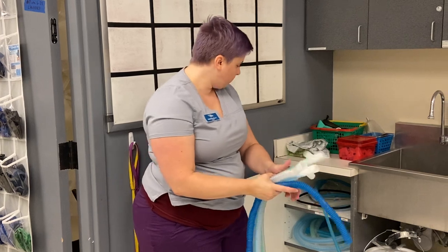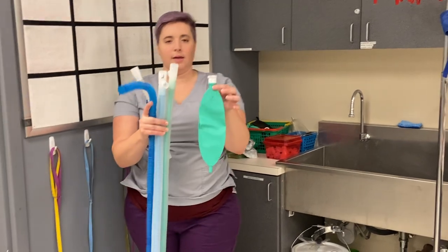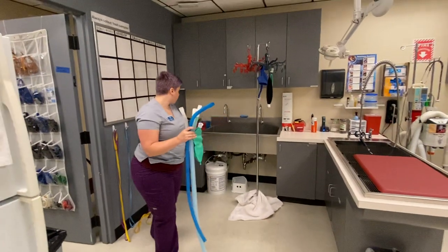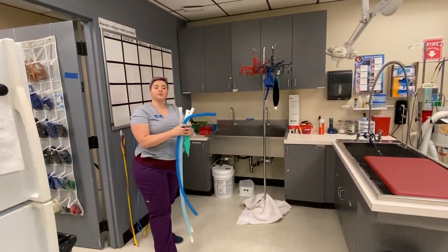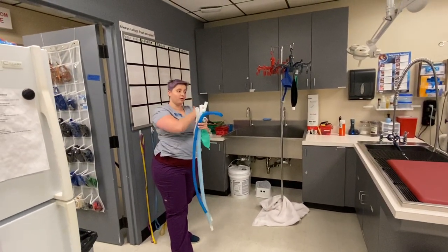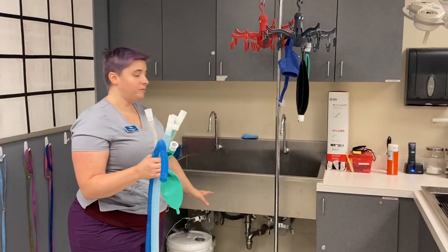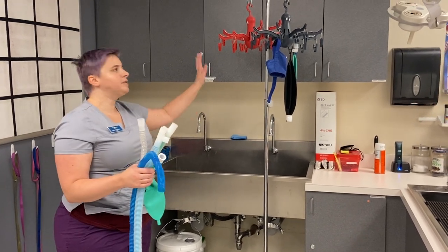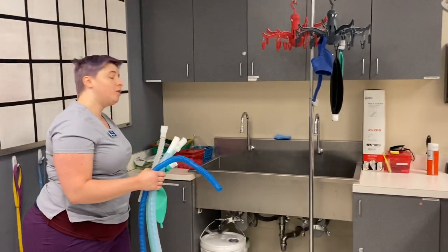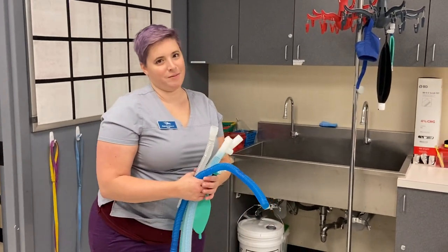I have my tubes and now I need to pick a bag — I'll grab a two-liter reservoir bag; liters are the unit of measurement for these. One quick note: please grab from this cabinet for the prep area. Surgery has their own circuit, so if you see one labeled 'surgery circuit' here, it's in the wrong spot. If you see hoses hanging here, they're hanging to dry — please do not pick from here, as we don't want to use a wet circuit. If there are none left, let an instructor know and we'll show you how to dry them.